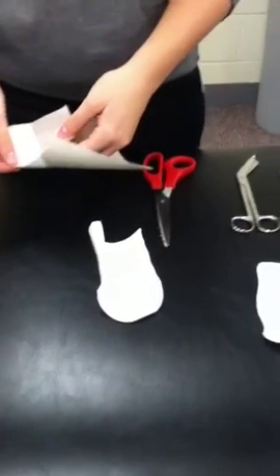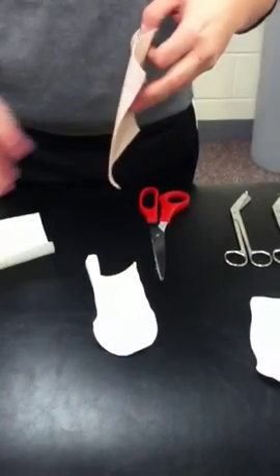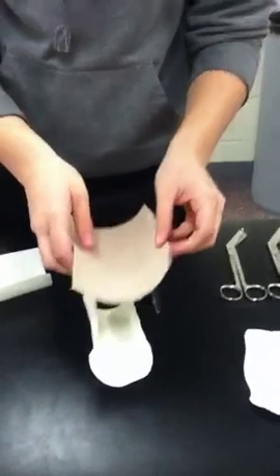And then we're going to take it back over here to our table where we have our moleskin. This is our product right here. And what we're going to do is apply the soft moleskin. We're going to peel off the backing. This stuff will stick to itself, so you have to be careful.